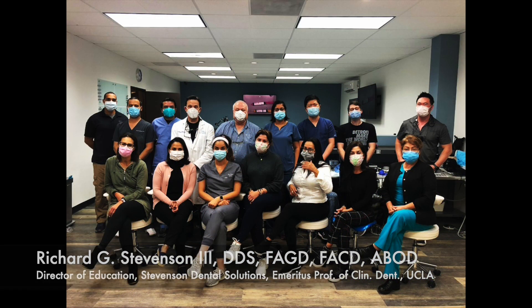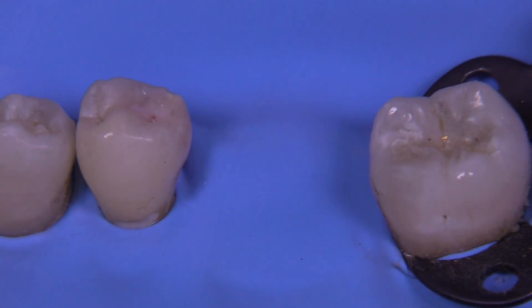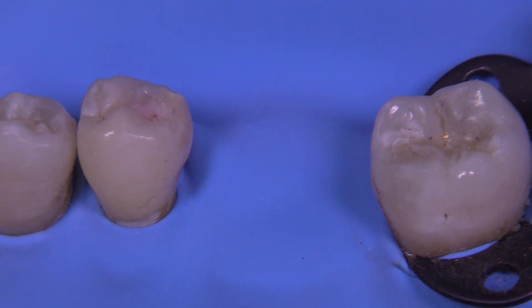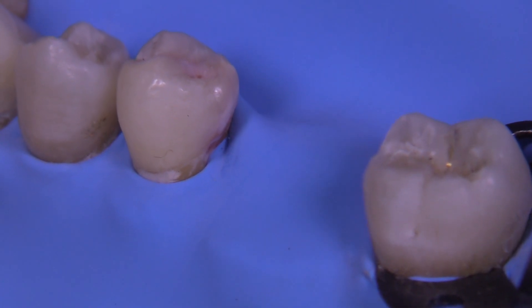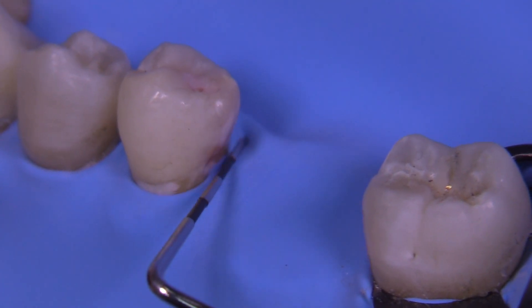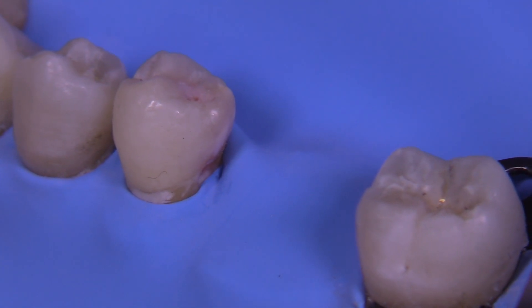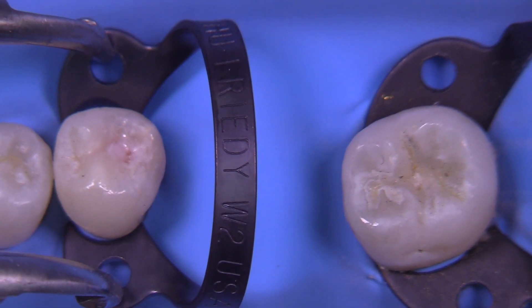Today we're going to take a look at a root caries situation, otherwise known as the Gingivally Extensive Margin Elevation technique. On this premolar there's significant decay on the gingival third root area — technically this is root caries, it's not really class 2 caries — and we're going to try on some clamps and try to get access.